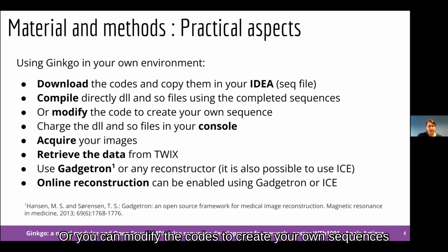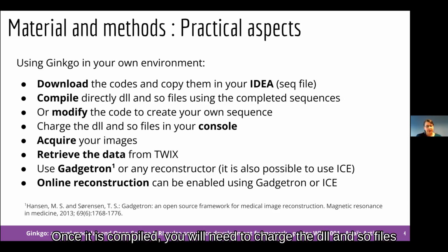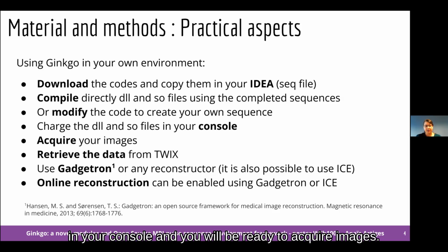Or you can modify the code to create your own sequence if you want, and then compile them. Once it is compiled, you will need to load the DLL and SO files in your console, and you will be ready to acquire images.